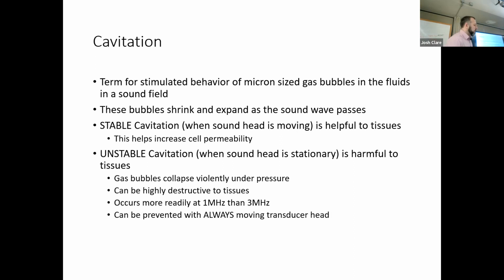We're going to look at ways to do it. We're going to practice a bunch. We can practice it with the machine off. If you're one of those people that are really having trouble, you don't have to turn the machine on. Keep the off switch and try to do the two things at once. Who's cooking dinner tonight? You can do it as you're cooking dinner, right? Stir your pasta as you're messing with your temperature settings. Set a timer as you're melting your butter, right? There's ways you can practice this. Whatever you're making, make extra. We'll have it for next week.